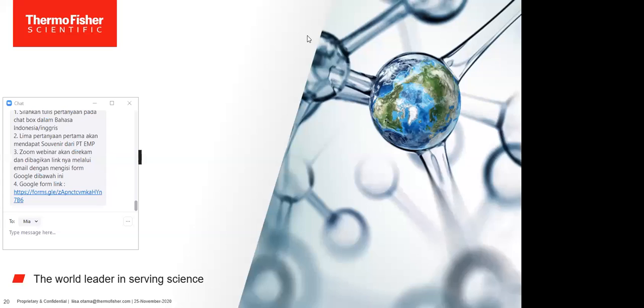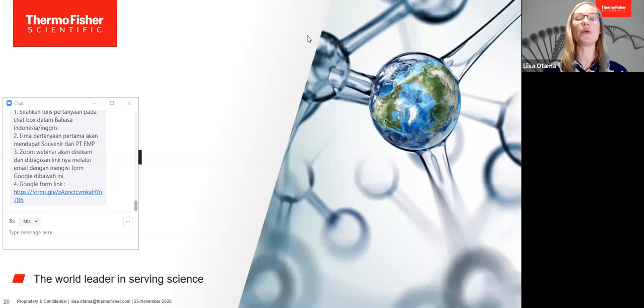Ryan answered that for the TKN method, after the sample is digested with sulfuric acid offline, the measurement can be done using the Gallery system. Do you want to add? Yes, this is correct. Of course, for the Kjeldahl, there is the sample prep step, in a similar way as for the total nitrogen and the total phosphorus. So we somehow need to get the organic part digested.